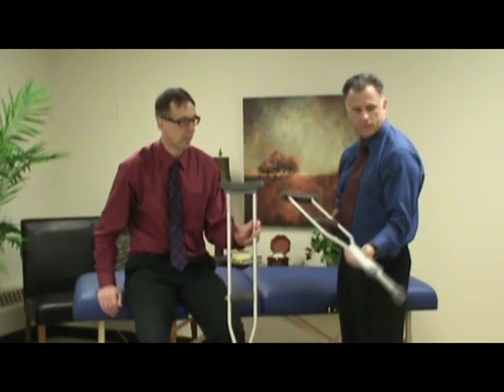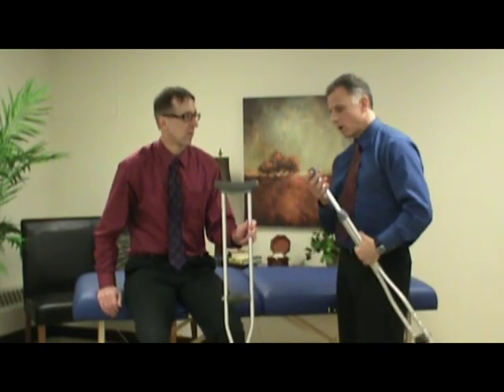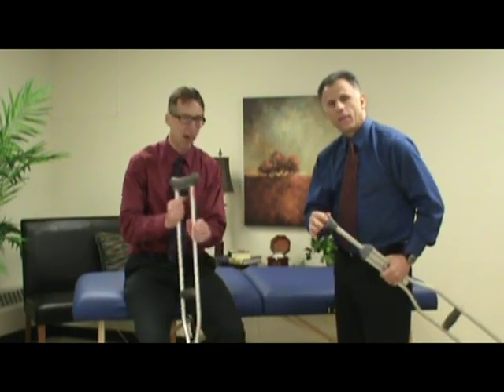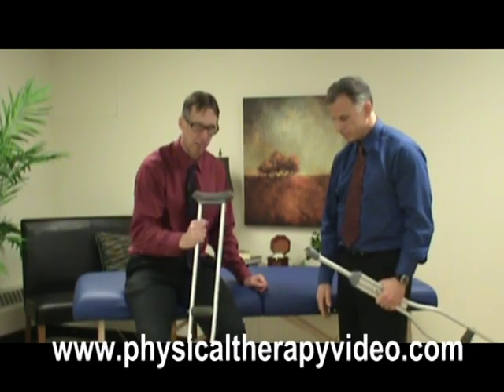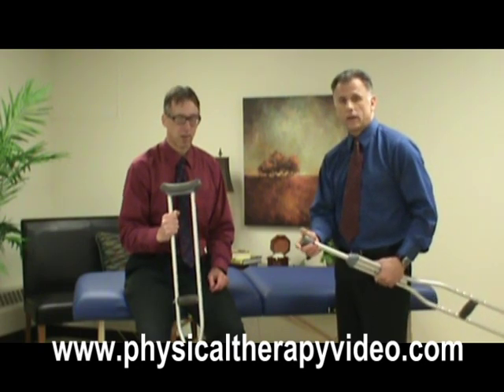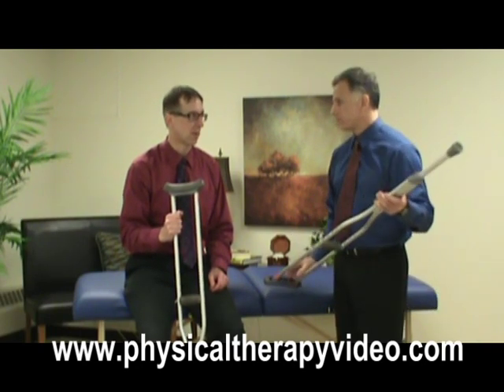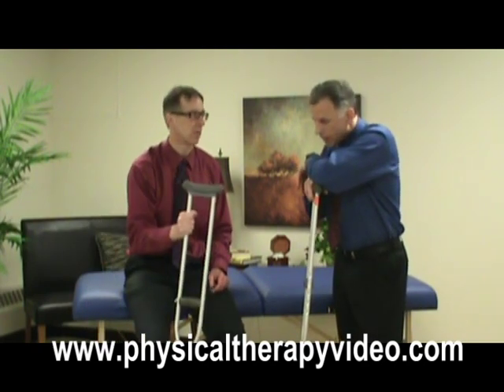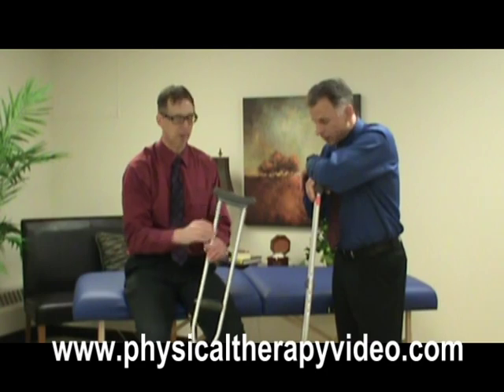And if you're going to get these from your Uncle Stuart or wherever you're going to borrow them, to make sure they're safe, check the bottom. Check the tip. I always go like this: is it grabbing, is it catching? If it's worn through to the aluminum frame, or if it's part smooth, that will really get slippery and you've got a problem. Rubber deteriorates over time, no matter if it's used or not, so you've got to make sure it's actually going to grip. Be careful on ice, it's a good place to fall with crutches.